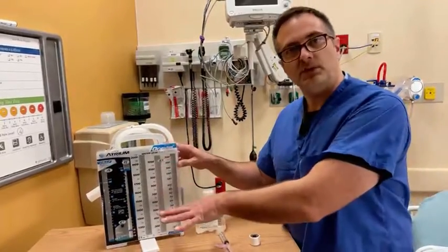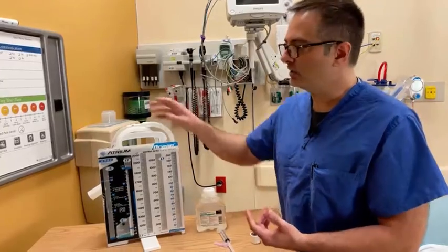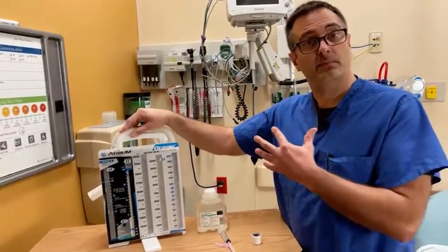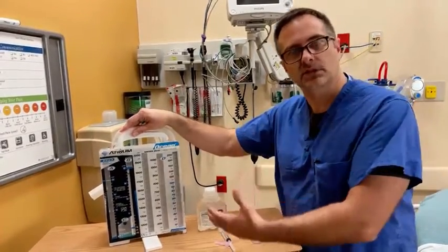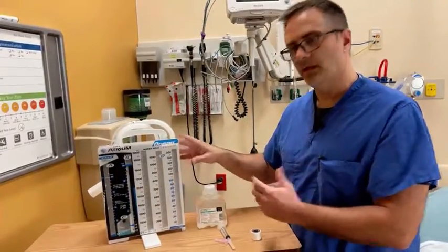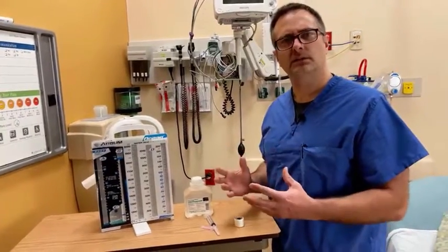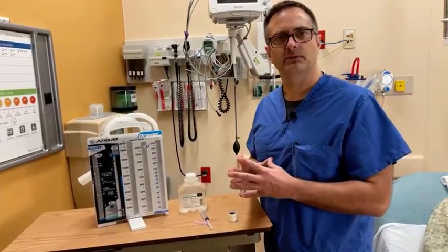When we hook it up to the patient at that point, it's what's called water seal or gravity drainage. If I hook it up to wall suction, then now I have the patient on suction. It will help facilitate the removal of air and fluid from the chest drainage system. So that's a quick overview of the components of the chest drain system. Let's take a look at one that's set up now and how it operates.